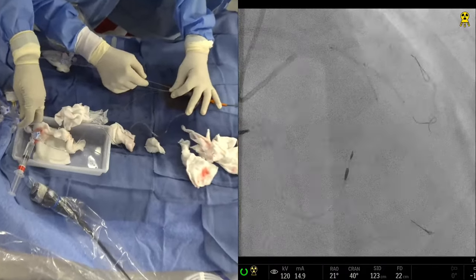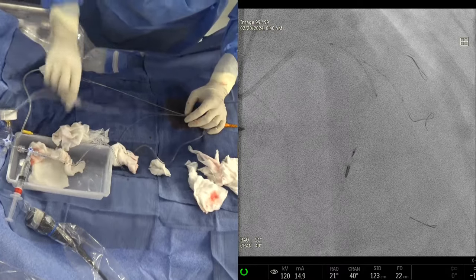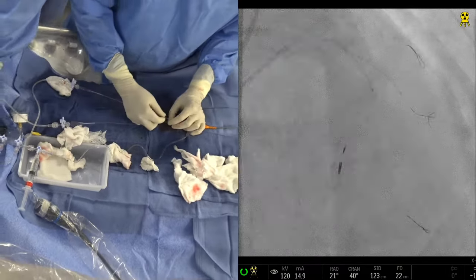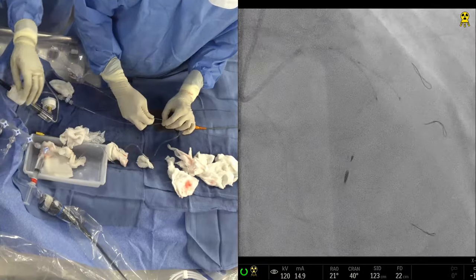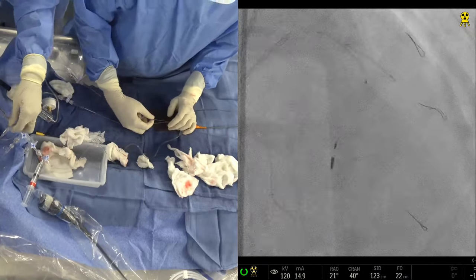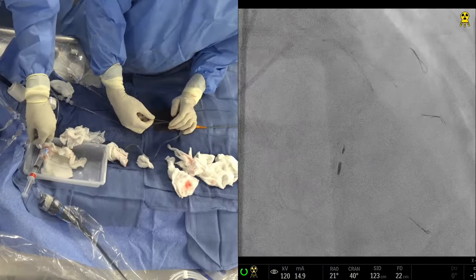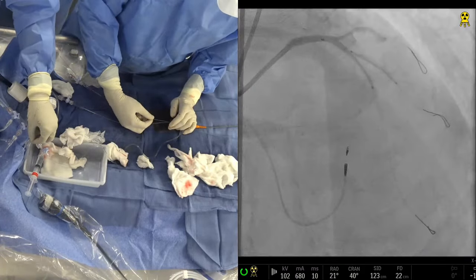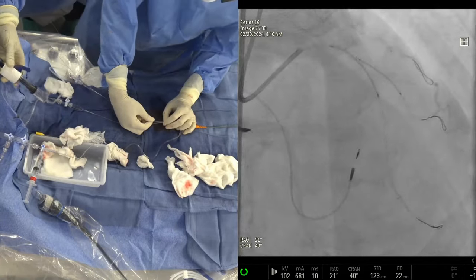Good. Okay, we are good. Deploy the D2 stent now. No. Hold on. The D2 stent is not even in position. Everything is good now. Do nothing. Okay, some die for the D2. Take a cine then. You came back a little on the D2, good. Yeah, that's good. Looks very good. Okay, go up for the D2.